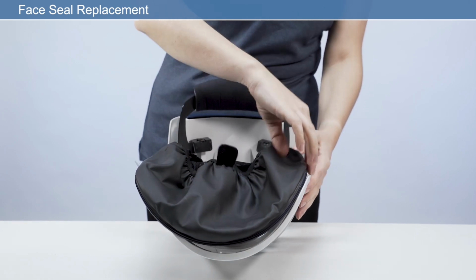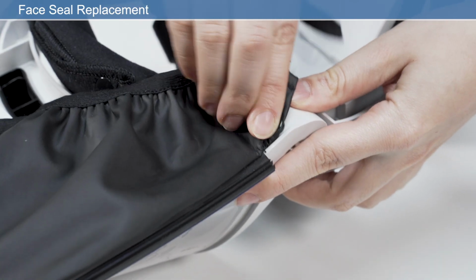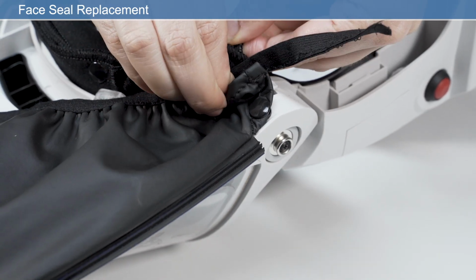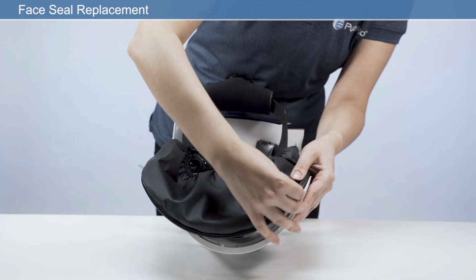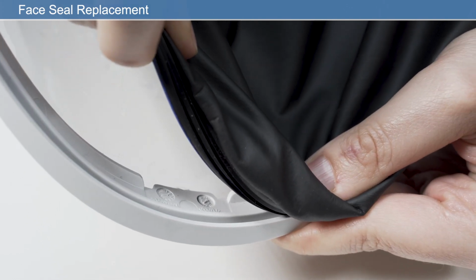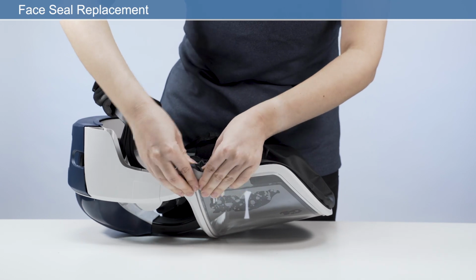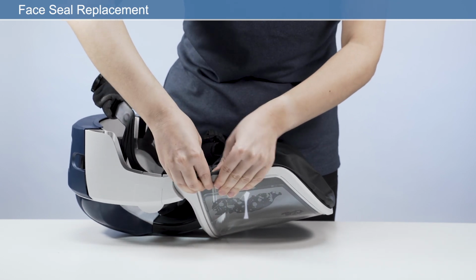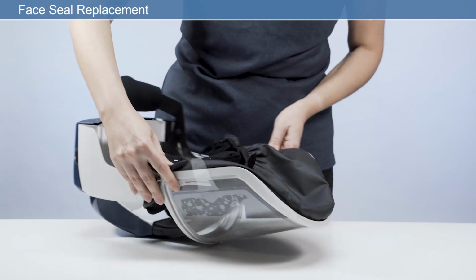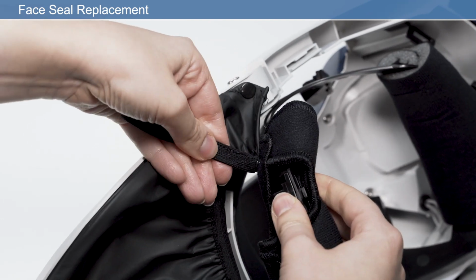Then, starting at the start of the face shield frame channel at one side, firmly press the ribbed edge strip fully into the channel until you reach the end of the channel on the opposite side. Finish by reattaching the press fasteners on each side of the frame to secure the elastic straps around the headband.